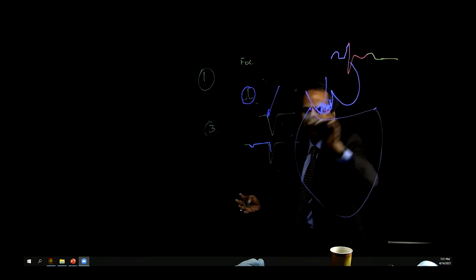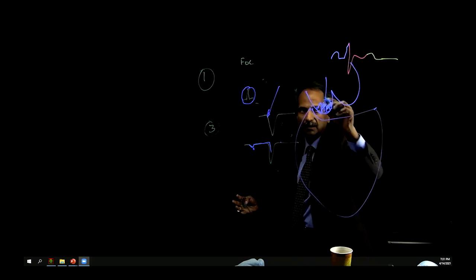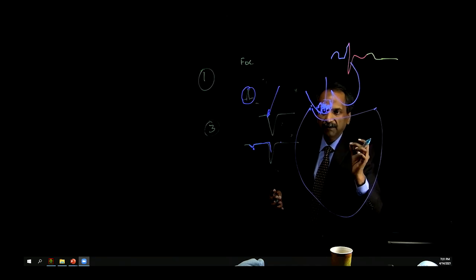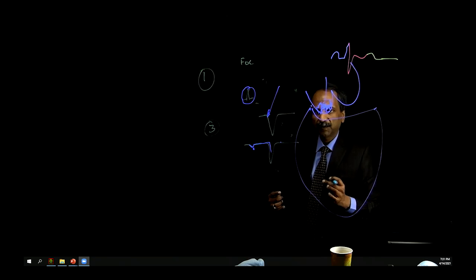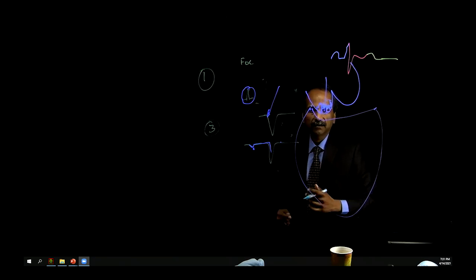So unipolar having this pattern, slightly negative, then very negative. But the bipolar signal, however small it is, is going to be sharp and giving you the control there. So consider your cases where you've had pulmonary vein ectopy or a supravalvular source of PVCs. Sometimes even focal arrhythmia in the middle of diseased tissue or scar. Those are times when we would get this mismatch.